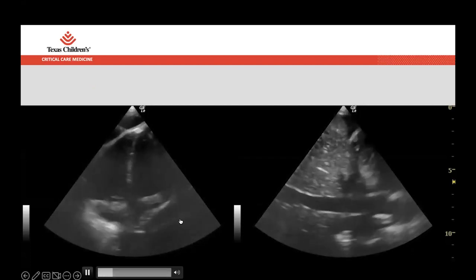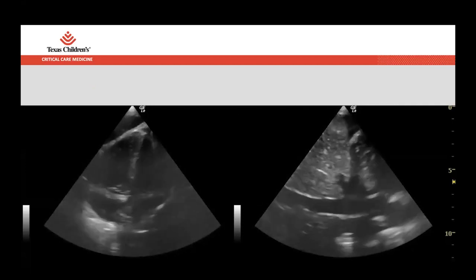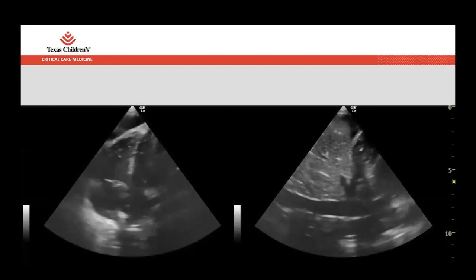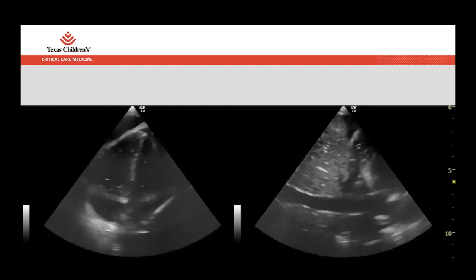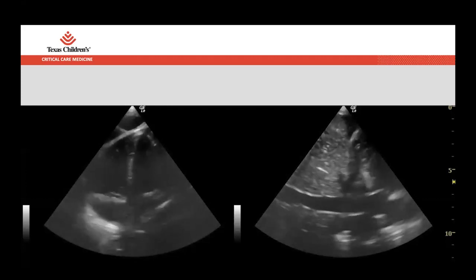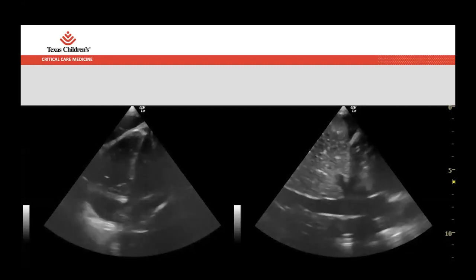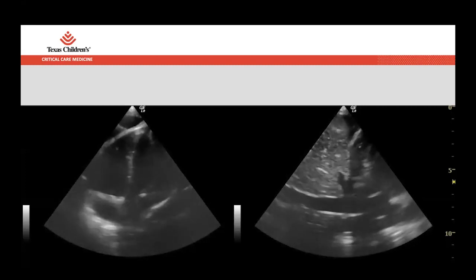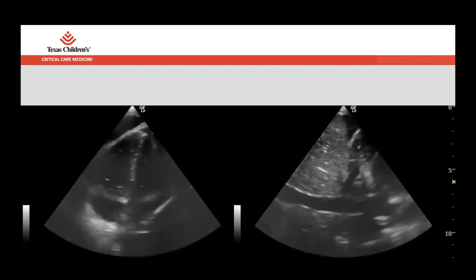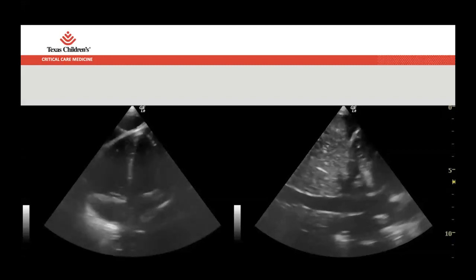This is one of those things where we're in the PICU, we're at the extremes of physiology. This is a patient whose lungs were just really, really bad. So we have, in a way, RV failure, but a very PICU-specific RV failure, where we basically have collapsed lungs on ECMO. We just were not able to move blood well through the heart to the left, but then it's like, well, why isn't the circuit doing more? That was the question.